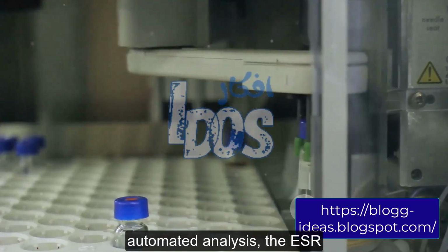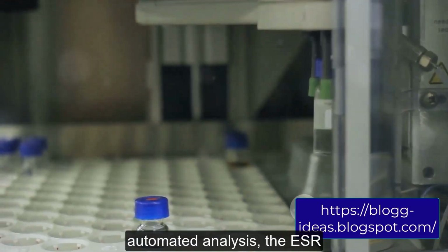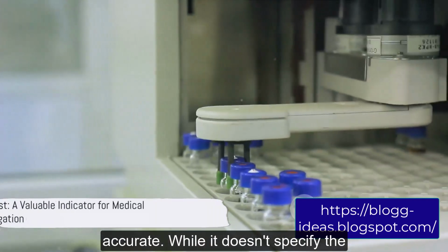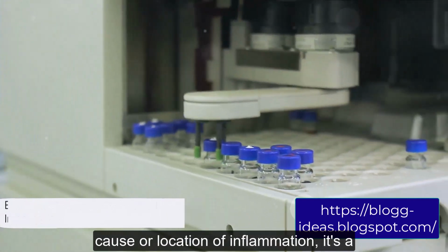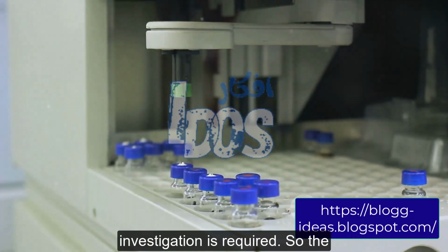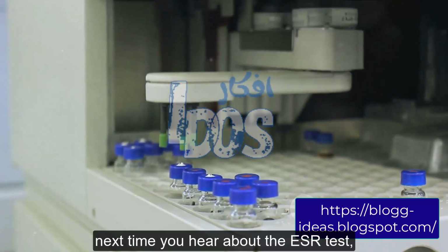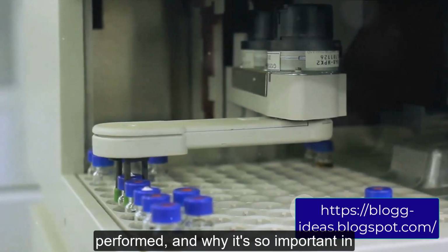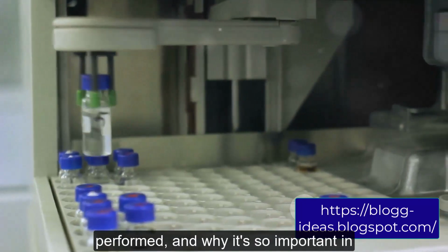With the advent of automated analyzers, the ESR test has become more efficient and accurate. While it doesn't specify the cause or location of inflammation, it's a valuable indicator that further medical investigation is required. So the next time you hear about the ESR test, you'll know exactly what it is, how it's performed, and why it's so important in the medical world.